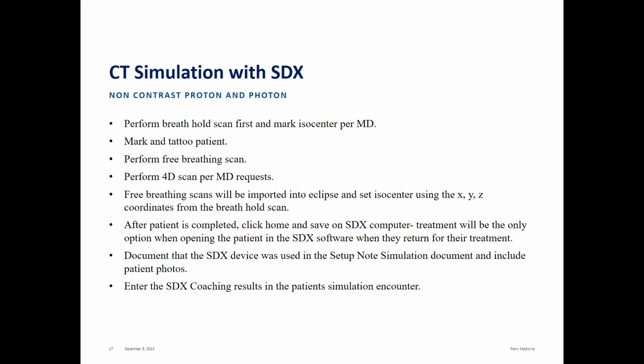For CT simulation with SDX, this will be the flow that we follow for non-contrast scans for proton or photon scans. So first you're going to perform that breath hold scan, and you're going to mark the isocenter per the MD request. You'll mark and tattoo the patient. You're going to perform a free breathing scan as well. And some of our doctors do still request a 4D scan if the patient passes SDX, so you'll do the 4D scan as well. That free breathing scan will just get imported into Eclipse, and you're going to set the isocenter using the same X, Y, and Z coordinates from the breath hold scan.